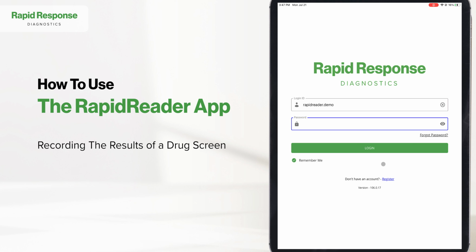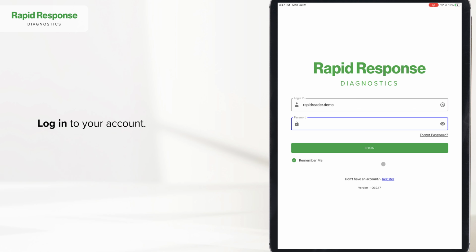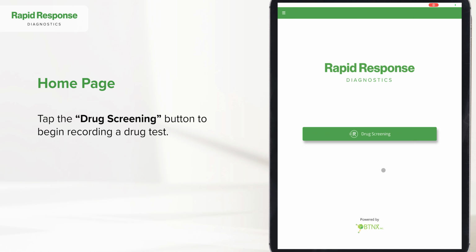How to use the RapidReader app. Recording the results of a drug screen. First, log into your account. Tap the drug screening button to begin recording a drug test.